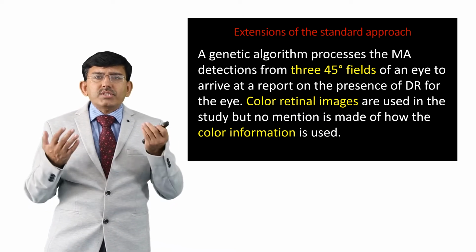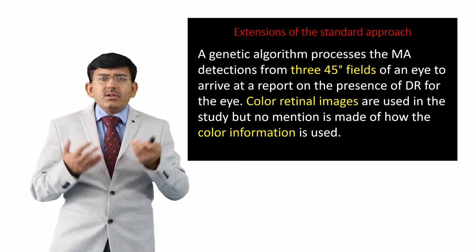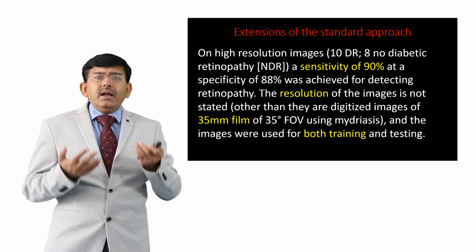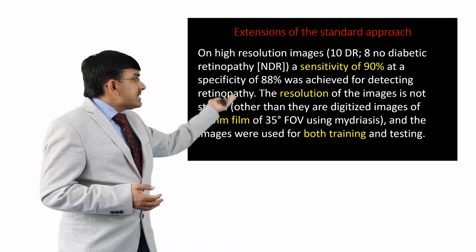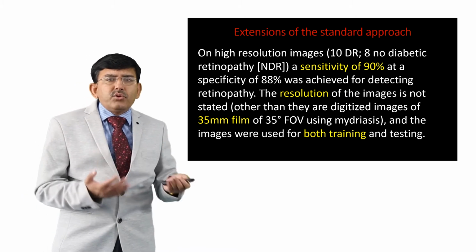On high resolution images, 10 diabetic retinopathy, 8 no diabetic retinopathy, that is NDR, a sensitivity of 90% at a specificity of around 88% was achieved for detecting retinopathy.